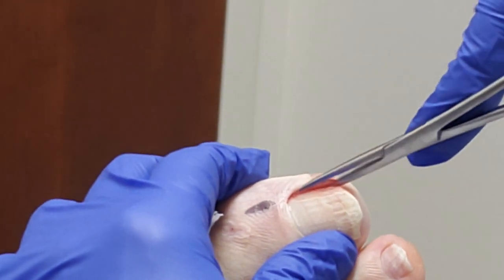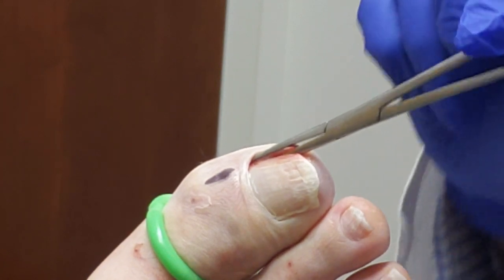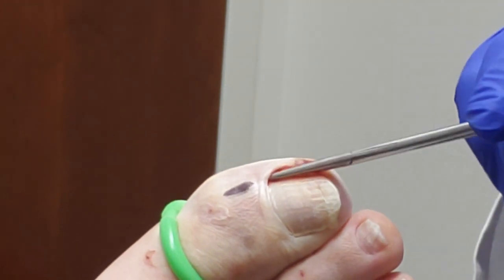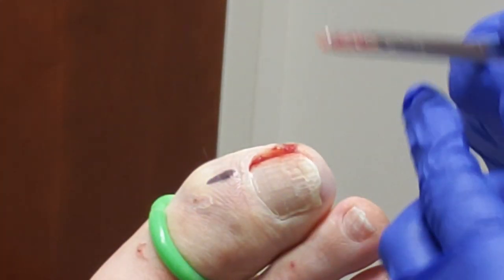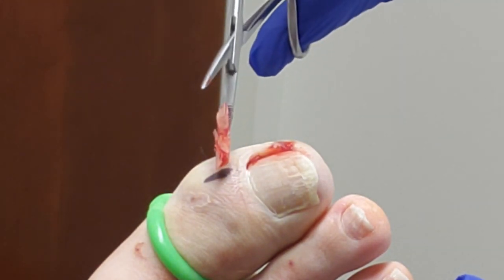And then what I do is I take the hemostat and go all the way underneath the skin. I grab it, and this is the key to not look like an idiot when you're doing this — you want to take your fingers out and then twist. Otherwise your fingers get kind of stuck. And you twist and then you lift and pull. And that gets all that nail that was stuck in there out. So that was the amount of nail that was in there.